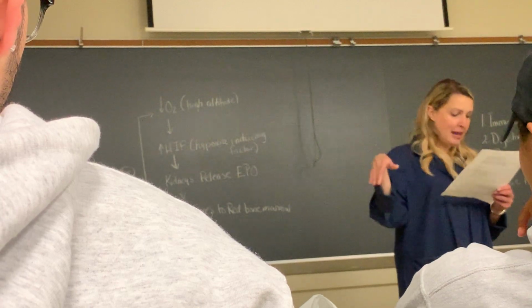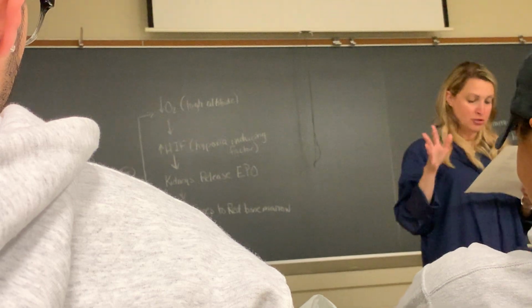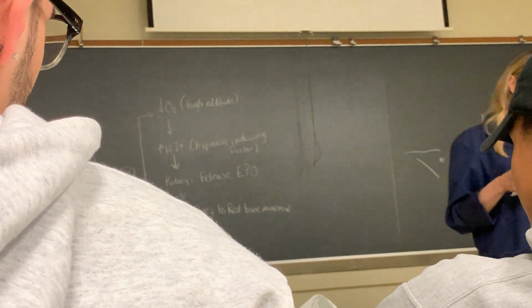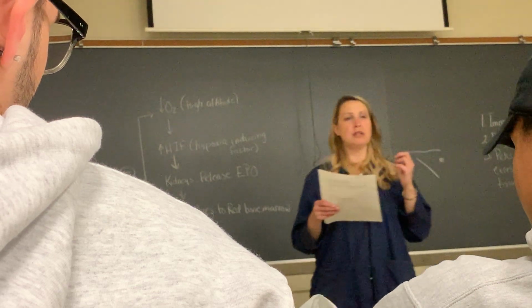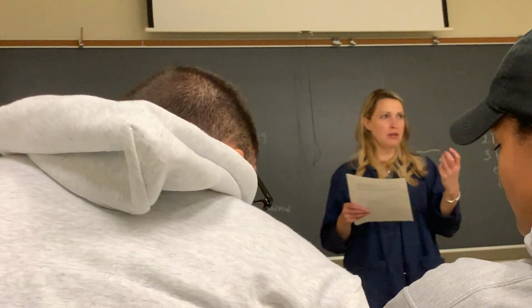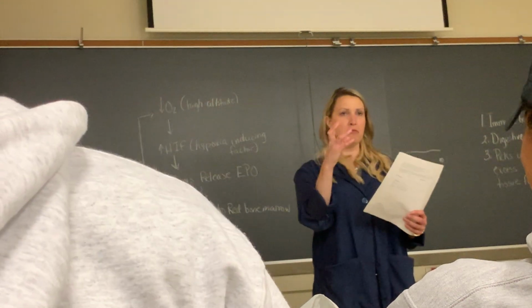All right, so anyway, we're gonna do hematocrit today. We already talked a little bit about that. I'll show you how to do it when we're finished with all this. We're gonna do the hemoglobin readings also. Now, hemoglobin is a little bit different. Here we're looking at the color of the blood to tell us how much hemoglobin there is in a particular volume of blood.